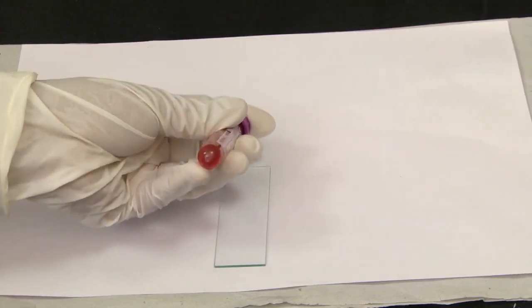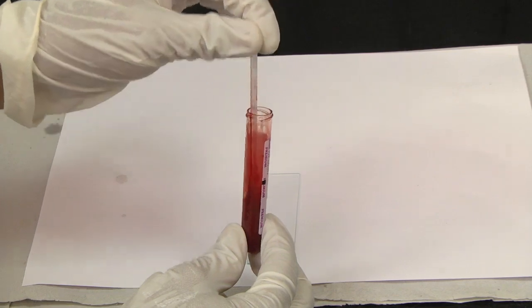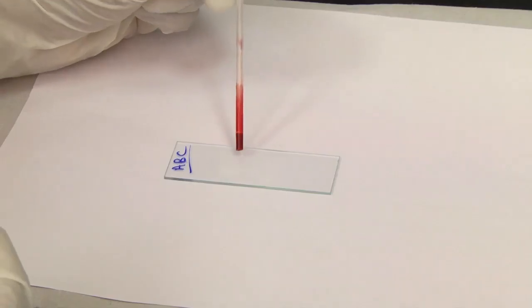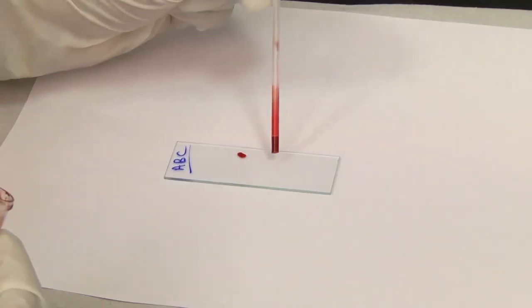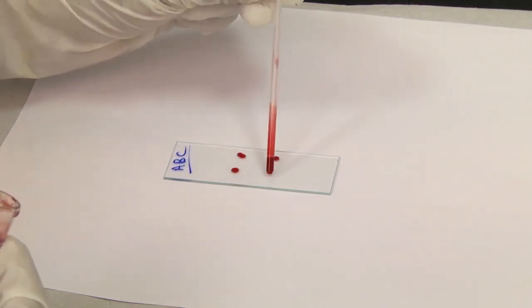Label a glass slide with sample identification number. Mix the sample by inversion. Open the cap gently and check for clots by dipping the applicator stick in the tube. Next, using the applicator stick, place 3 to 4 small drops of blood on the slide.